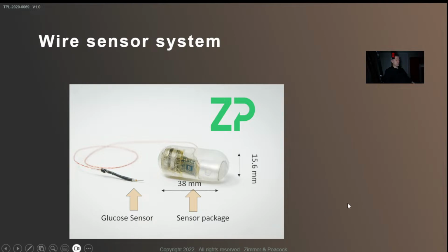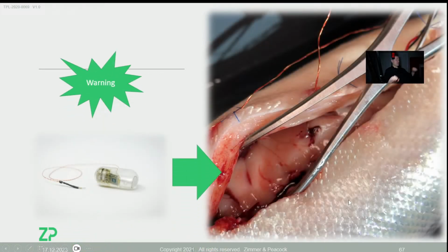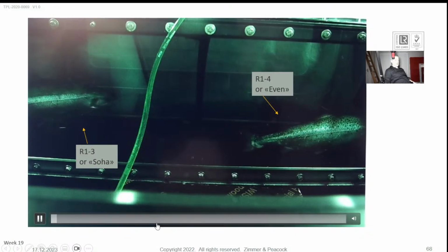And so what we're busy doing is, this fish is not dead, by the way. This fish is very much alive. It's just anesthetized, and what we're doing is putting in this sensing package. You could understand the millions of euros that have gone into this, because making something that's implantable and robust enough to continually measure biomarkers in fish is not that easy. So this fish is anesthetized, and they're basically going to suture it back up. You can almost see the sutures in here already. They're going to stitch this guy back up once they've implanted it.